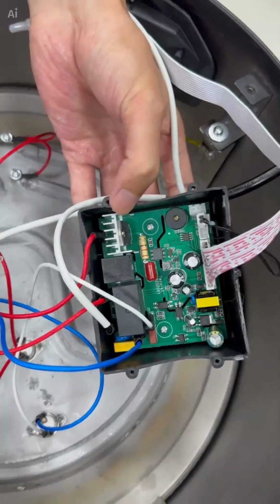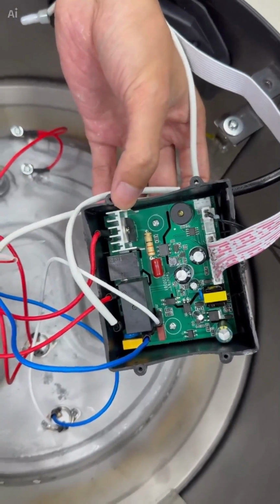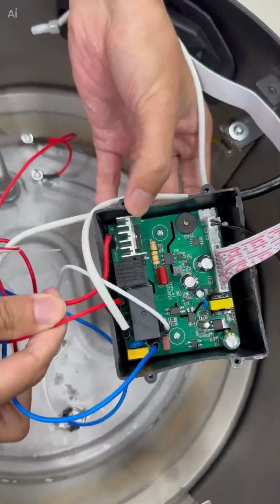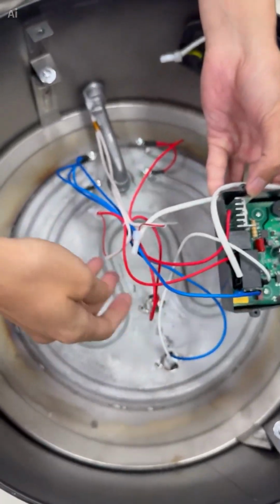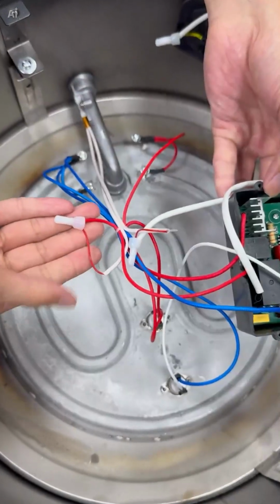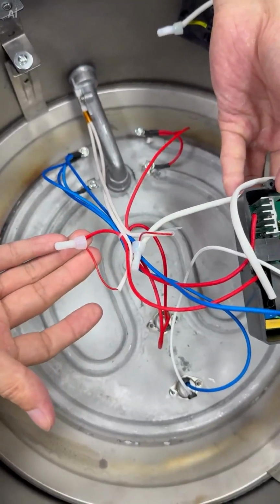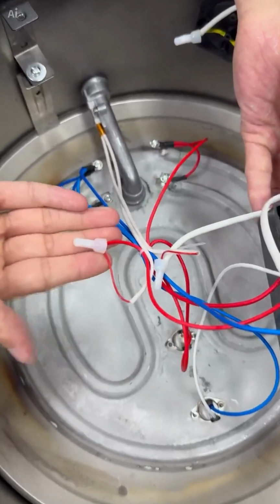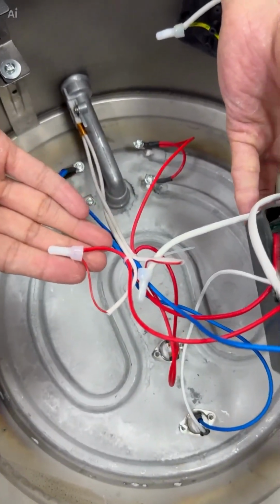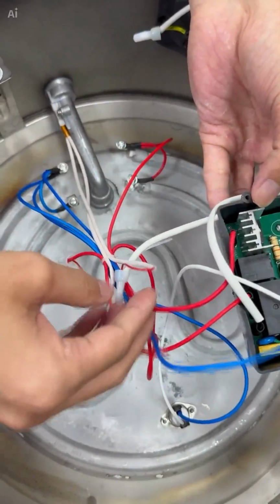You can see there are wires of different colors inside. There are 2 red ones which we need to remember. So we see there are 2 connectors inside. One of these connectors has only 2 wires, one large and one small. The other connector has 3 wires.